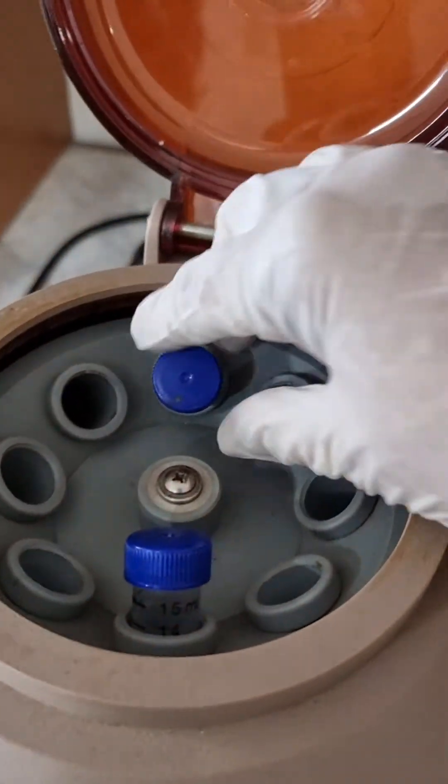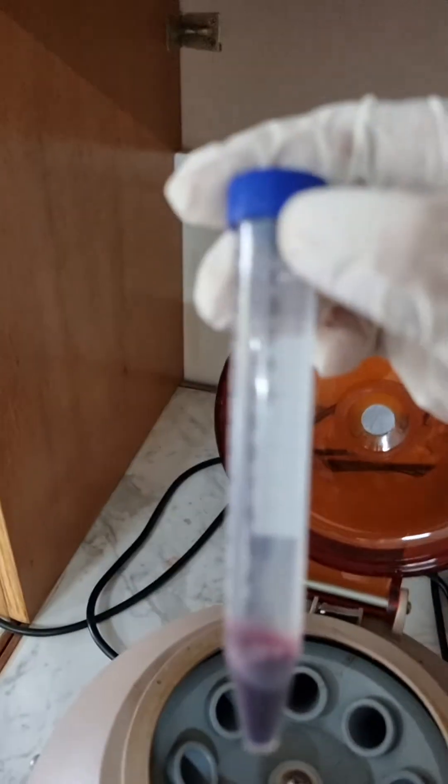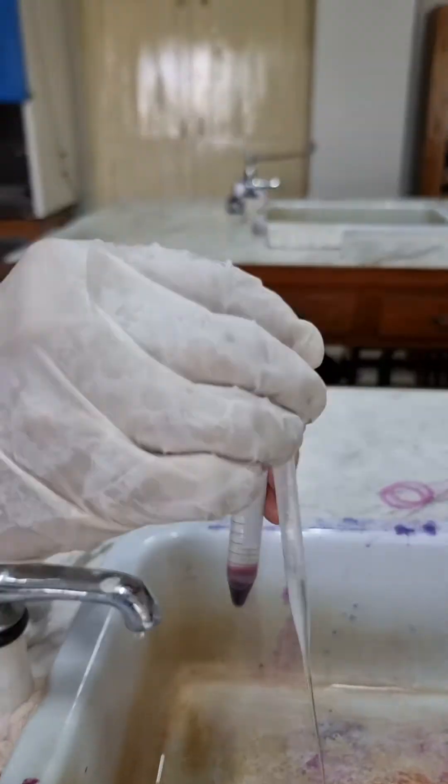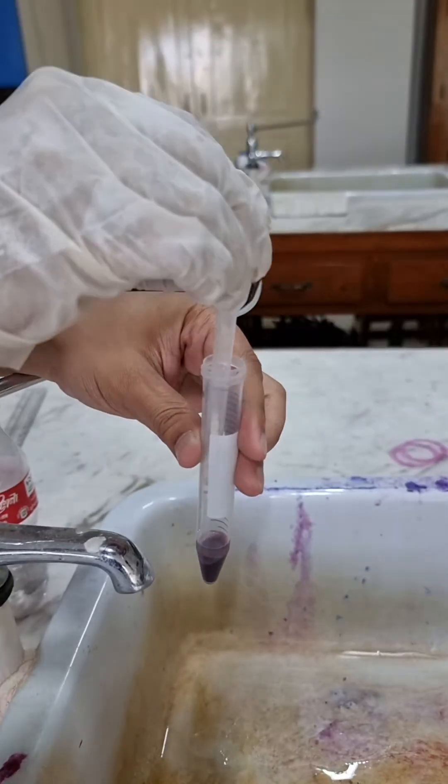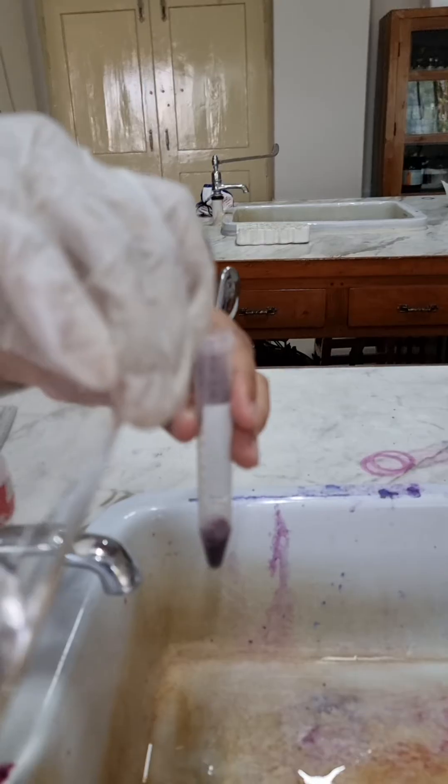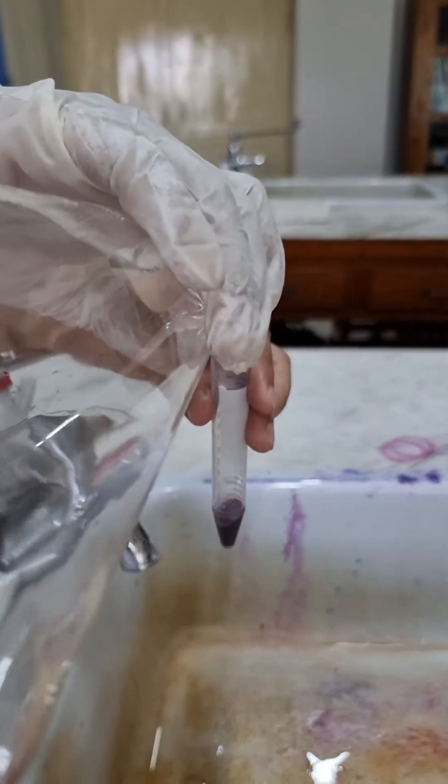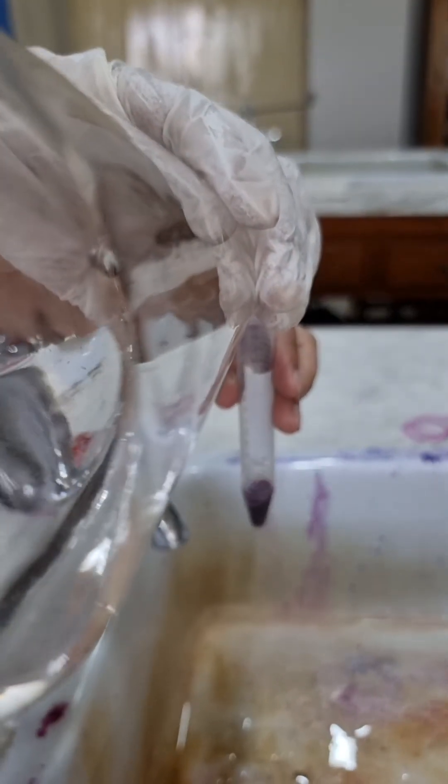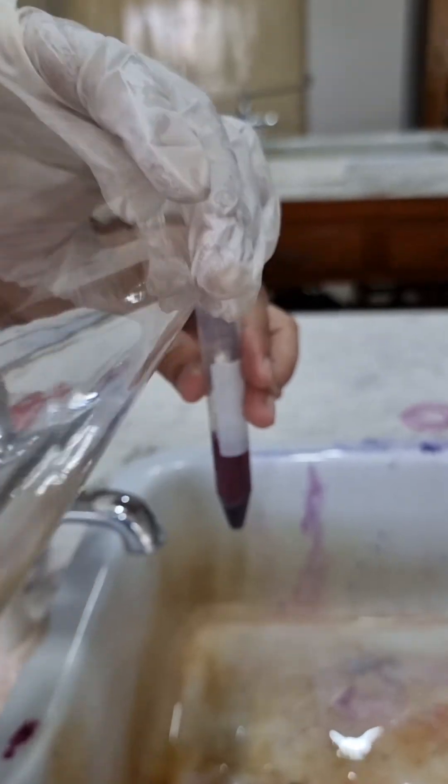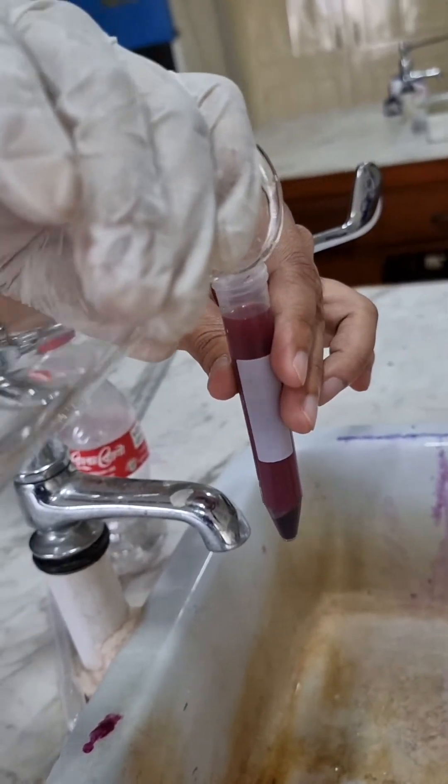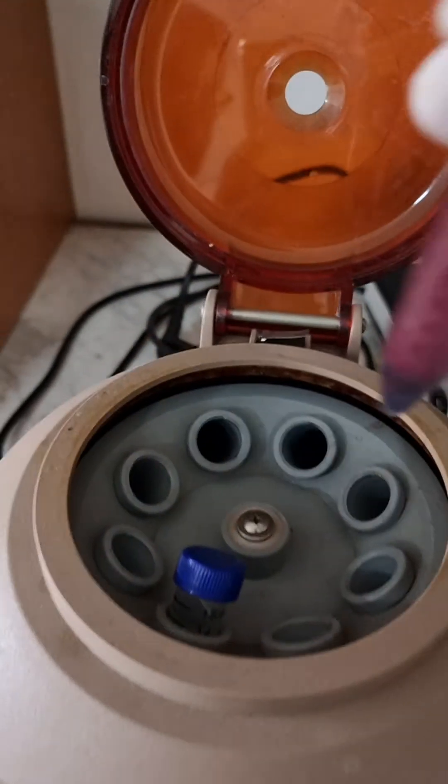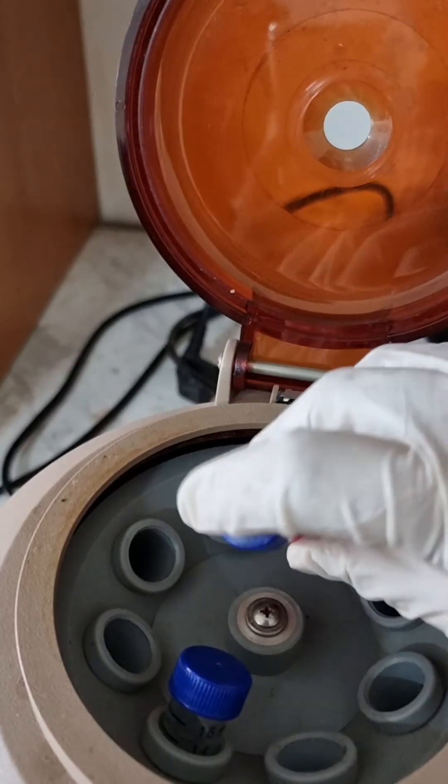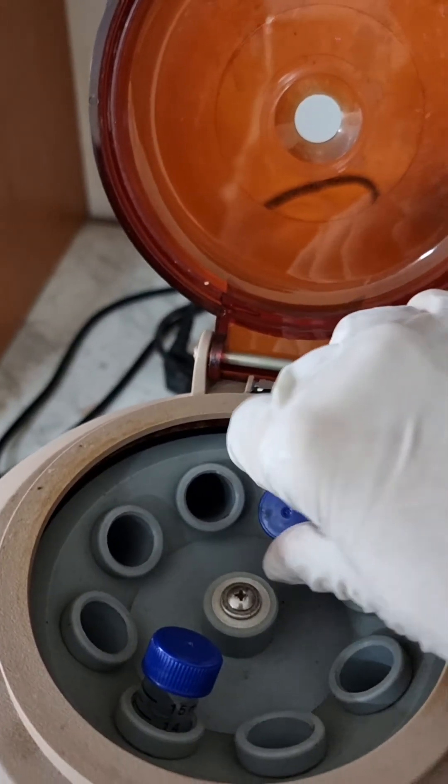After centrifugation, we dispose the clear fluid on top. Then again we have to add PBS to the pellet remaining at the bottom and then centrifuge it. We repeat this procedure three times.